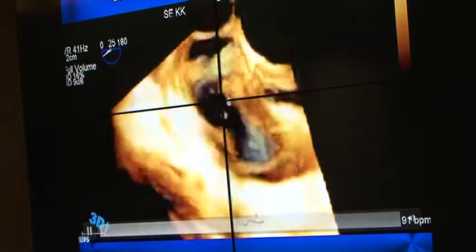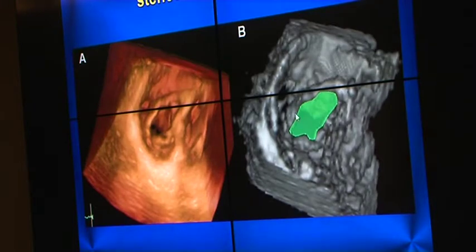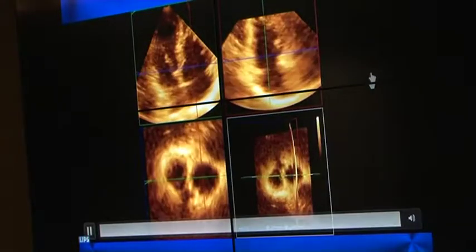Again, endocarditis and vegetations might be visible, and with the same method, completely the same method, we can accurately measure the stenosis, the valve orifice area, and the vena contracta of the regurgitation. It is not very often that we can have a nice overview of the prolapse. This is a posterior leaflet prolapse, but hopefully in the future we're gonna have better transducers with better image quality.